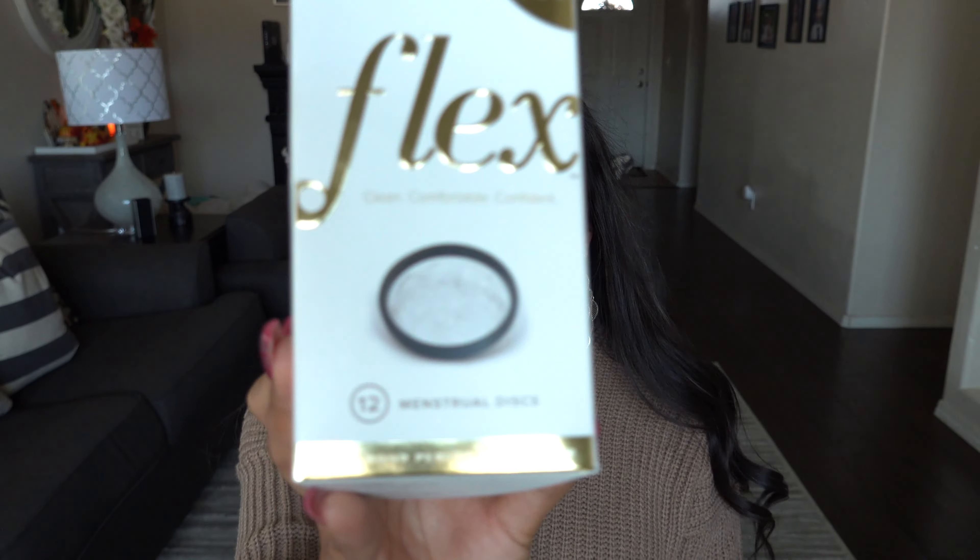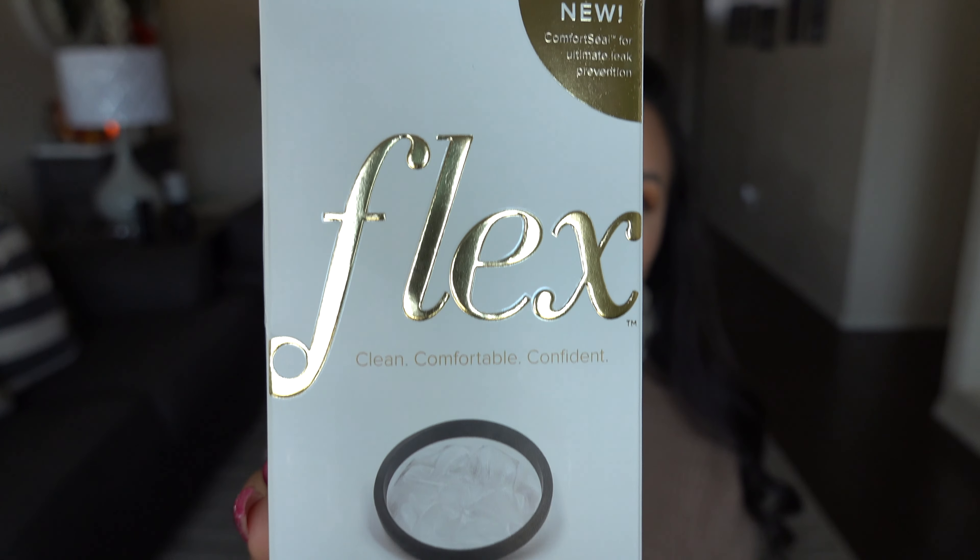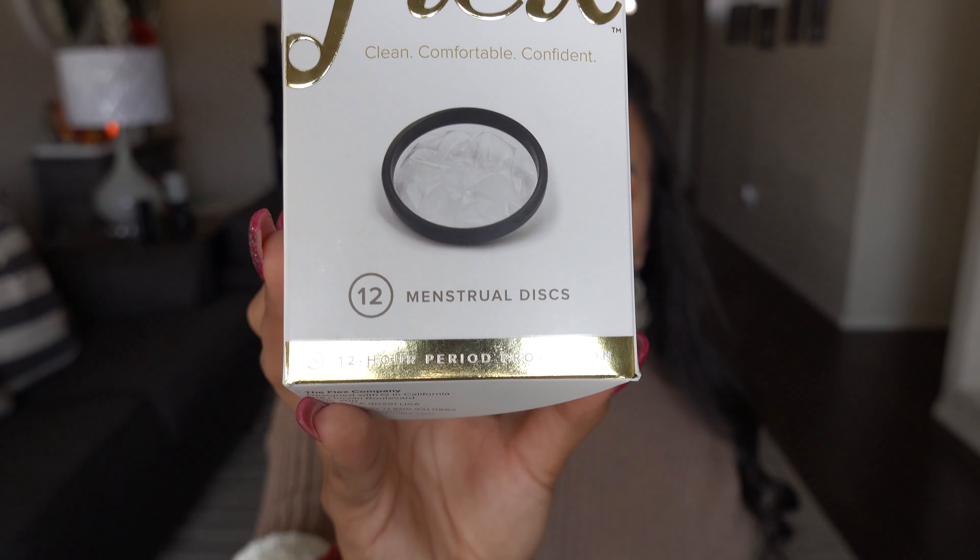So now I'm going to pull this out of the package and show you what it looks like. This is the box it came in — I think it looks pretty fancy. I bought this from Target for $14.99. You can also buy them on Amazon or on their website, flexfits.com. The same pack of 12 is $14.99, or you can buy a 24-pack for $27.99, and on their website they offer free shipping to anyone in the US.